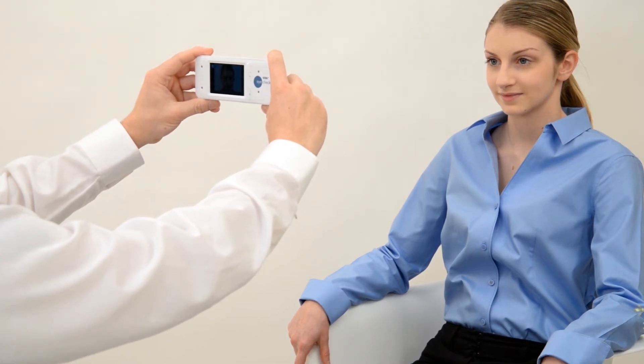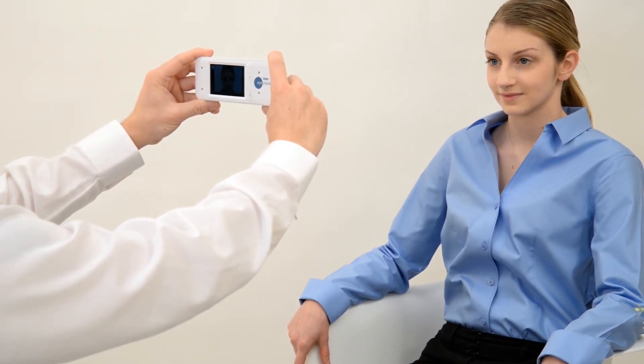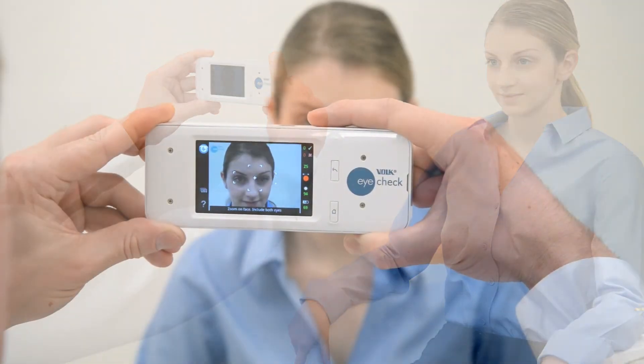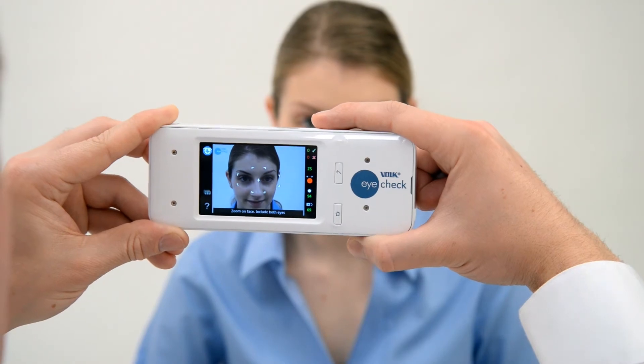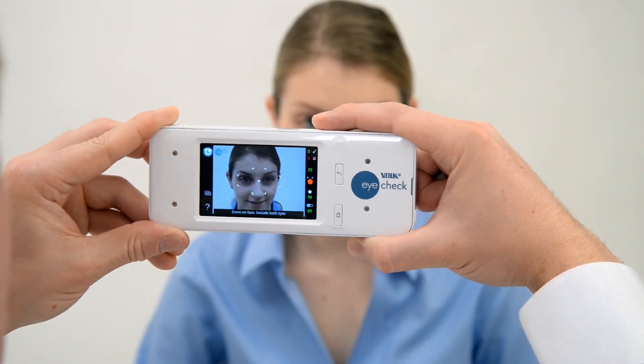The subject is required to look at this target whenever a picture is taken. Frame the subject's face, aiming for two-thirds of the face to appear on the screen from forehead to mouth.